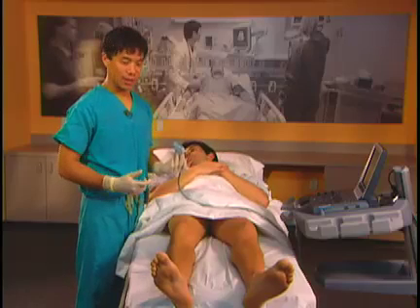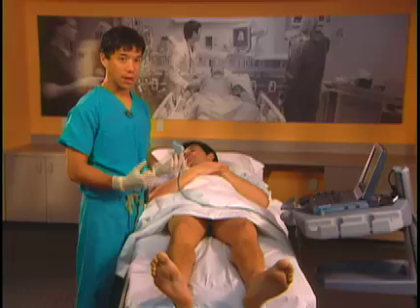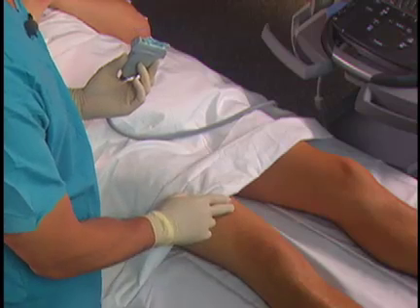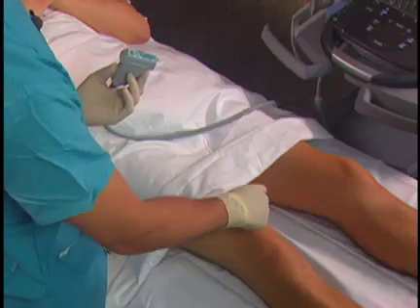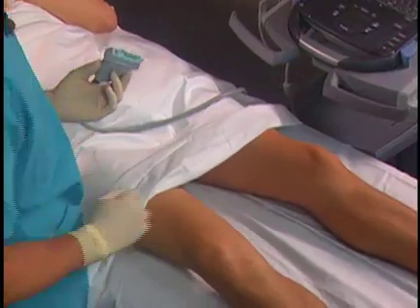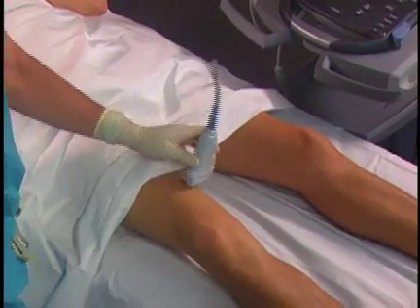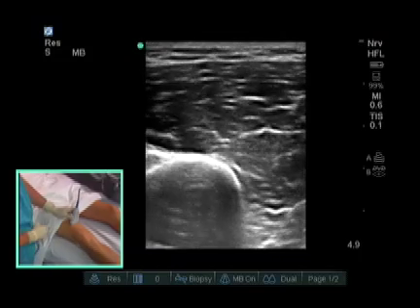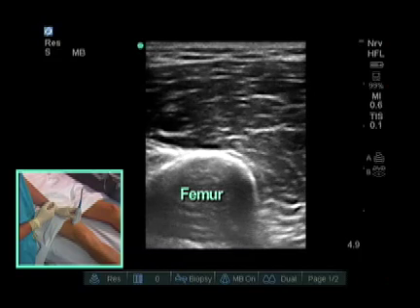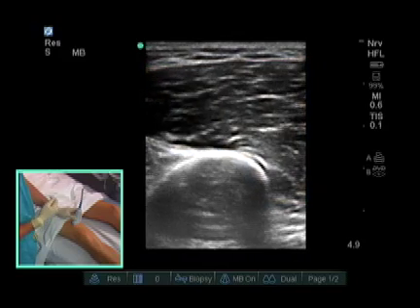This technique is useful in elderly and obese patients because we're using muscle landmarks rather than nerve or other small landmarks. We usually start about 10 cm above the knee and put the probe on the medial side of the leg. We can abduct the leg a little bit to give us better visualization. We like to start more anterior, which gives us a view of the femur — the hyperechoic stripe — as well as the vastus medialis, which can pretty much be found in everybody.